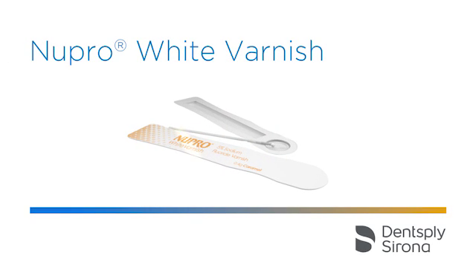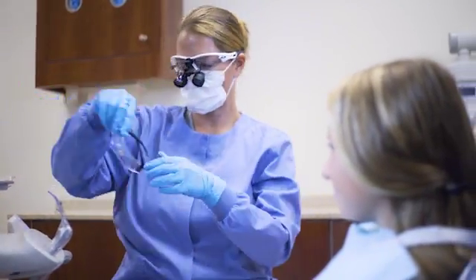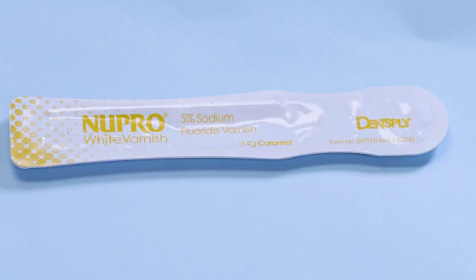Nupro White Varnish releases higher levels of fluoride in two hours. Applying Nupro White Varnish is fast, convenient, and easy. Nupro White Varnish now comes in easy application packaging that you can sit on the dental tray or hold in your hand.